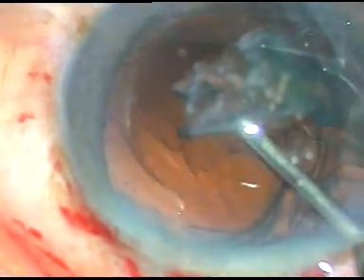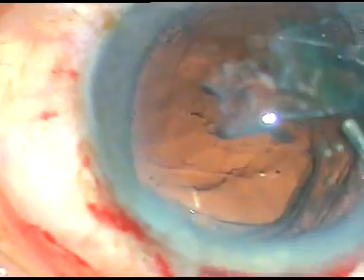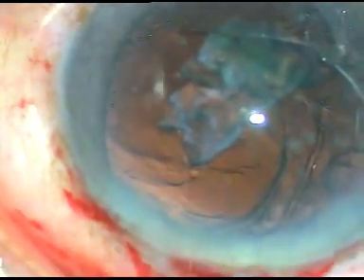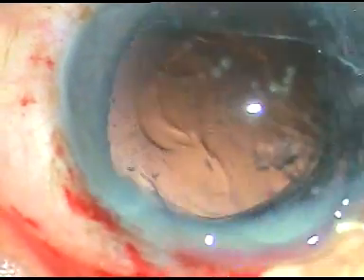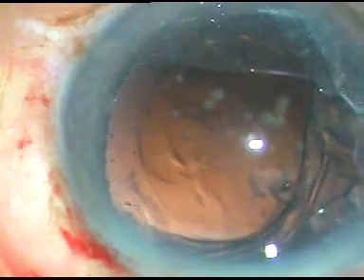Then what I did is this epinucleus which is there, I viscoexpressed it, means injected visco in the anterior chamber, depressed the posterior lip and it came out.